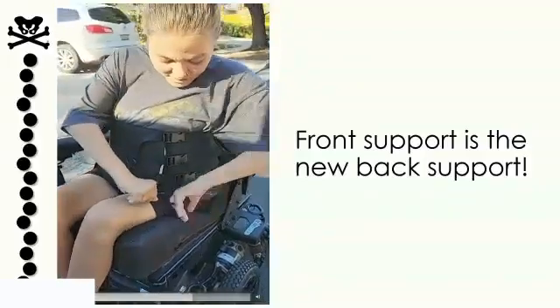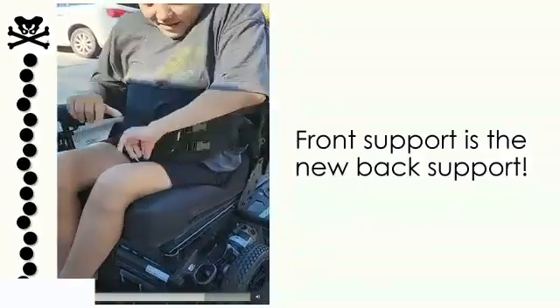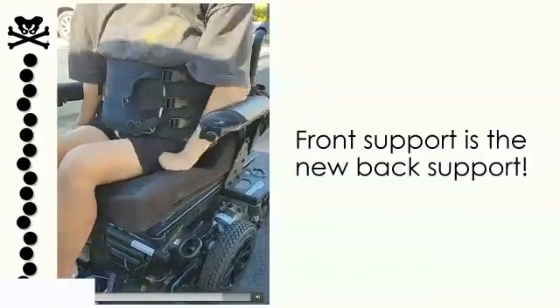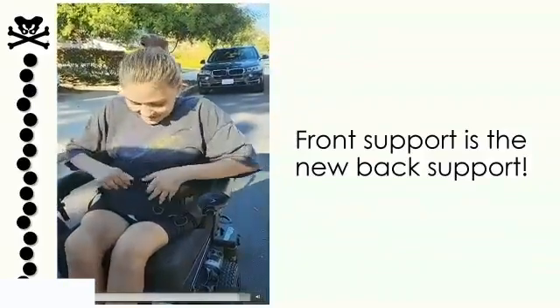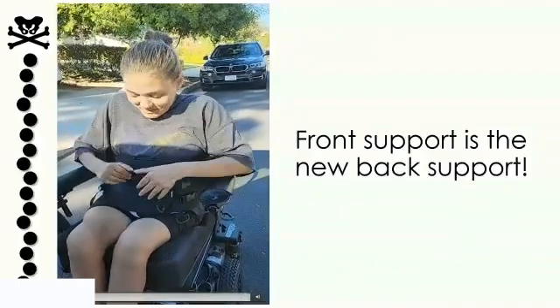You're either going to have to be in a tipped orientation, or you're going to have abdominal support, and there's going to be a fine balance in between the two. And you're not going to be able to hear it, but at the end here, she smiles so big and she says, I can breathe now. So for her, it's a really helpful device.